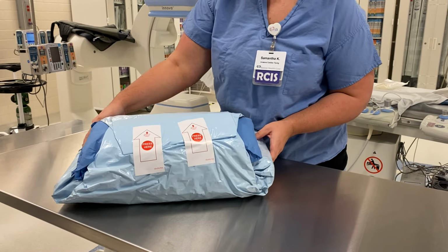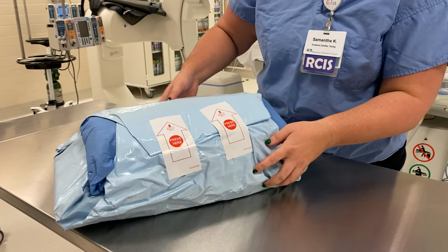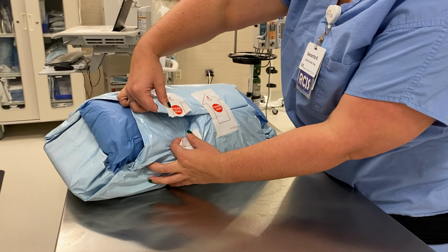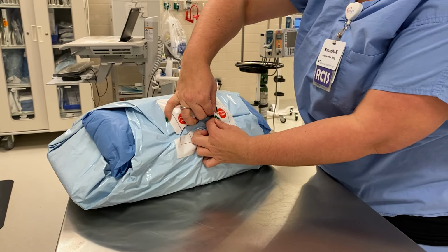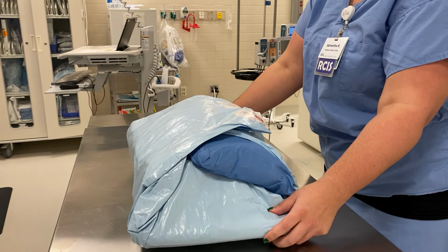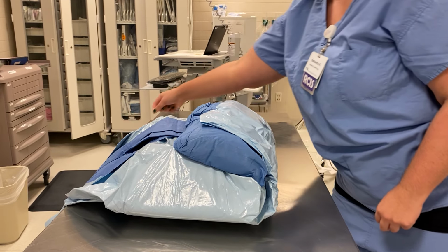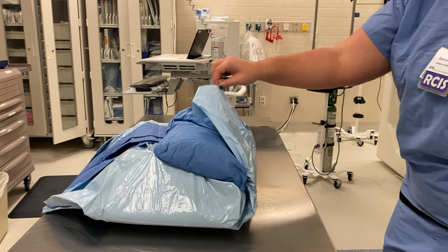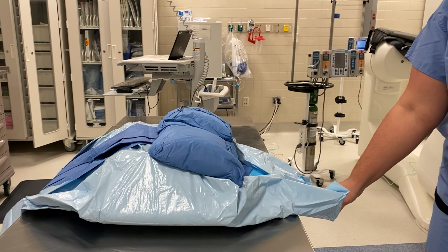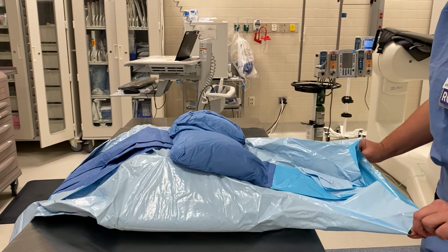And then here we're just going to follow the instructions on the tab, and this is where we're going to rip it open. So I'm going to push my thumbs in here and rip these two pieces apart. And then the first thing I'm going to do is flip the back of the table away from me and the front of the table towards me. Now this is all going to be considered to be the underside of the drape, so this is why I'm allowed to touch it without having any sterile gloves on.